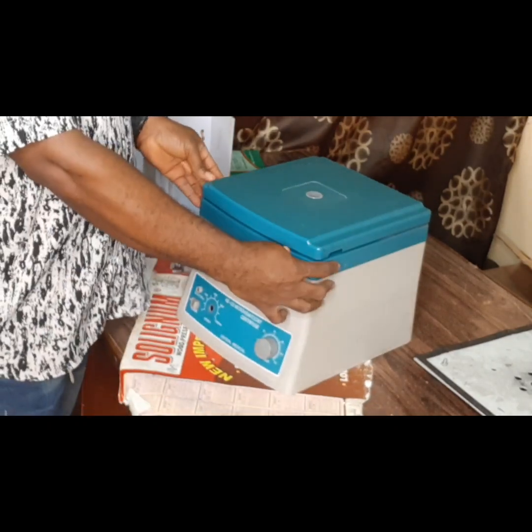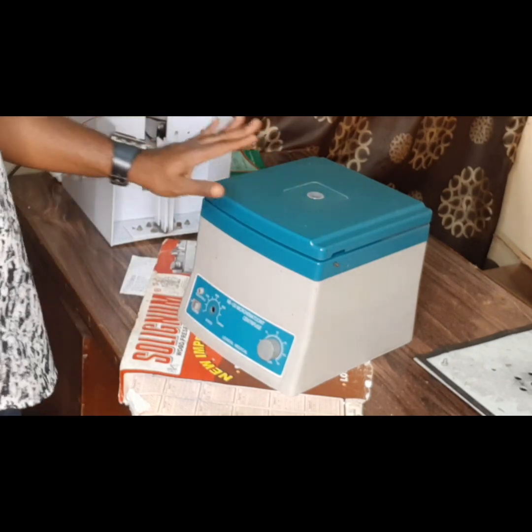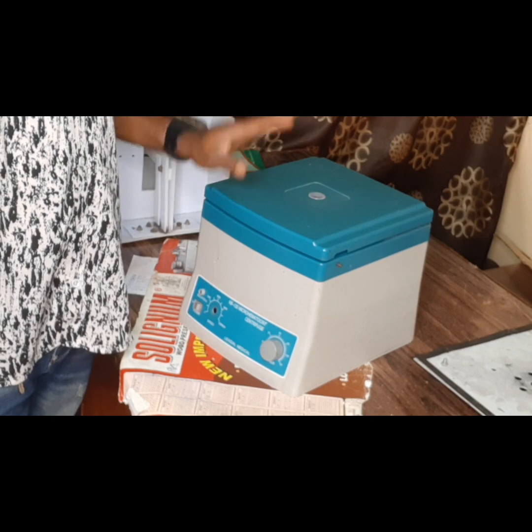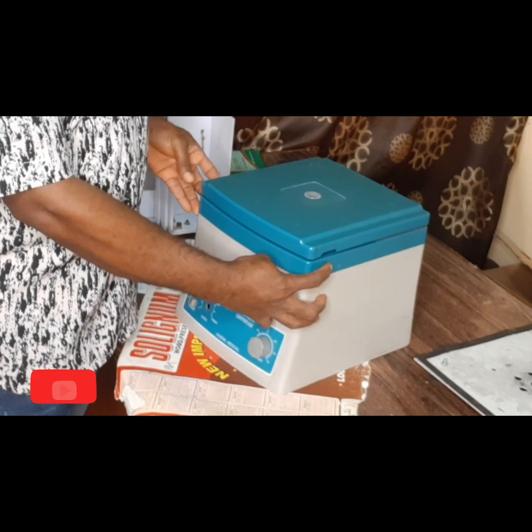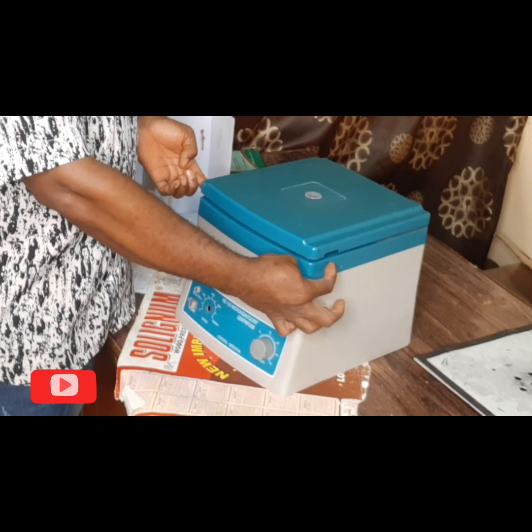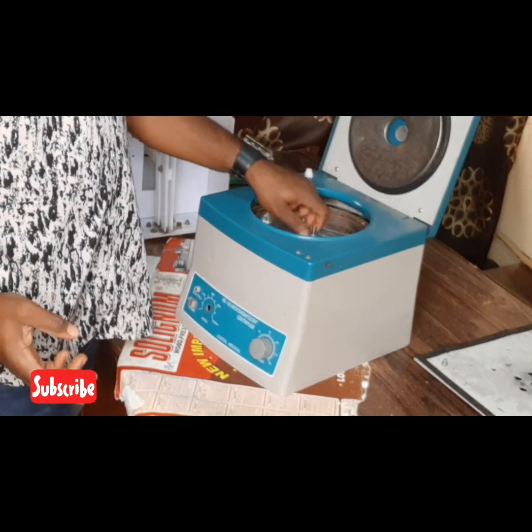Okay, so I'll have to open it by pressing this button here. Most of these machines you may find difficult to open if they are not plugged in, but this very one has a mechanical button here. You can see it. Once you press this button here, it will allow you access to it.